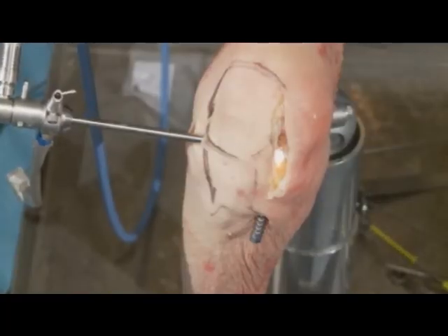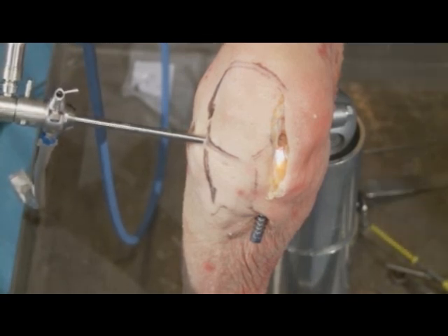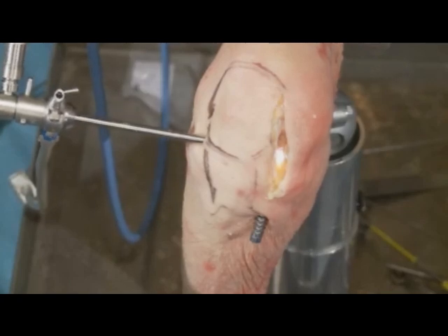Let's turn around and go to the specimen, and I'll show you how we get set up. I like to do these patients so that we do the tibia all arthroscopically, and then we'll convert to a mini open procedure for doing the femur.